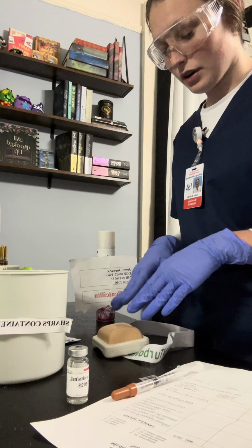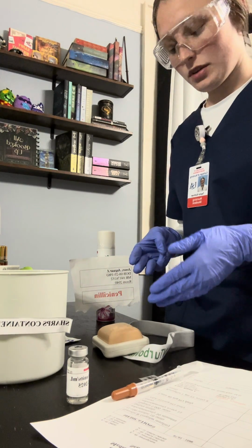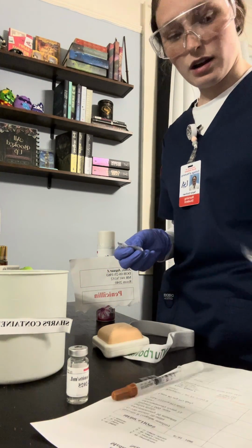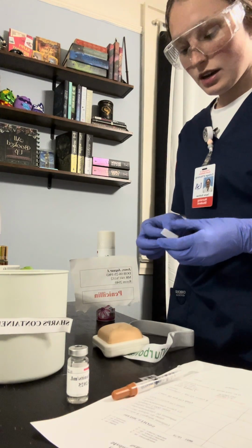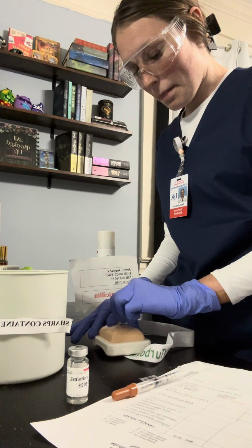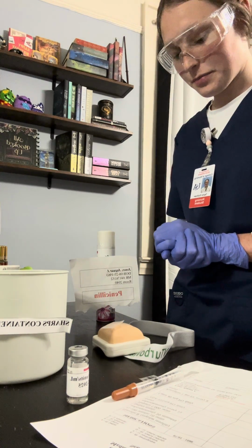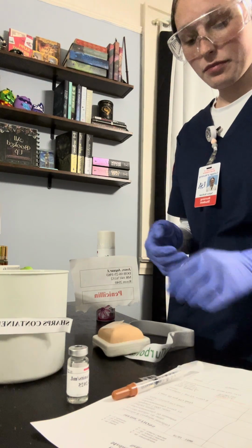But first I would assess the skin for any bruising, edema, or inflammation, and I do not see any. So now I am just going to clean the injection site, and then lay my alcohol swab right there as an indicator of where I'm going to be poking.